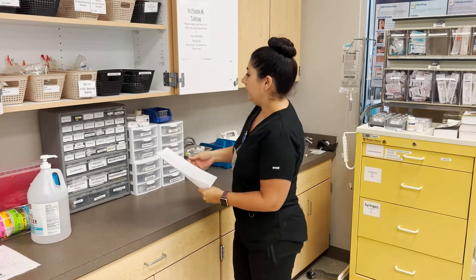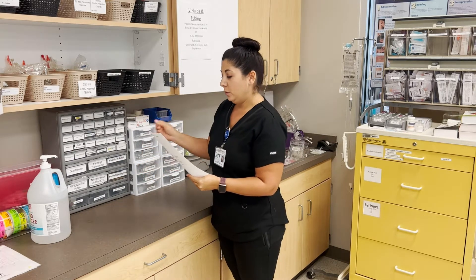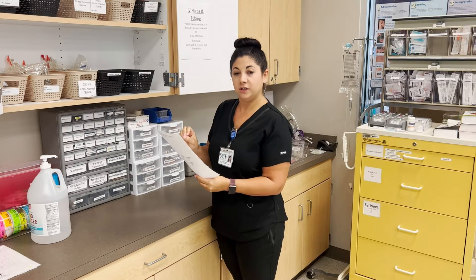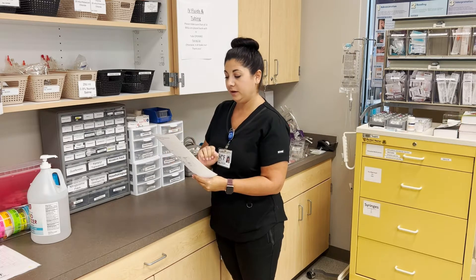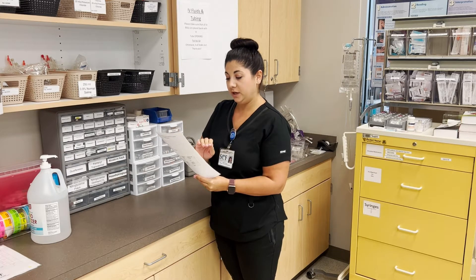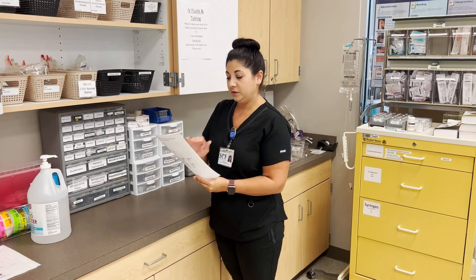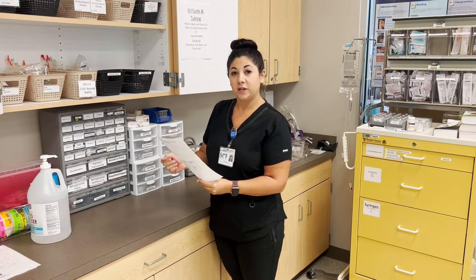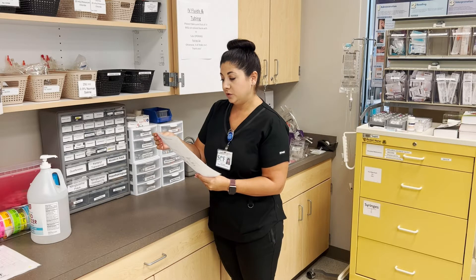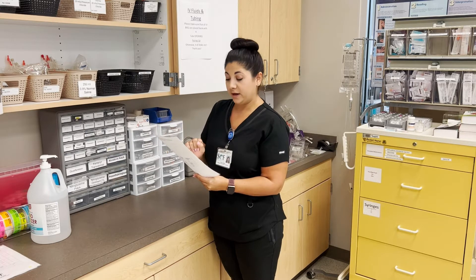Then I will pull the medications from our automated dispenser. Once I have what I need for each medication individually, I'm going to compare it against my MAR — looking at the med, looking at the dose, checking the expiration date to make sure they are not expiring, and making sure that the route is correct.